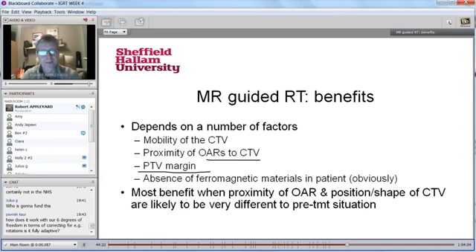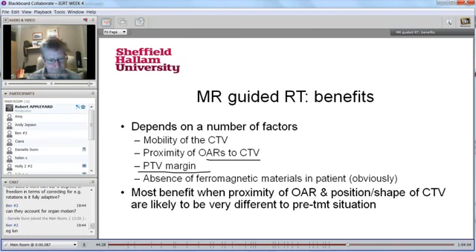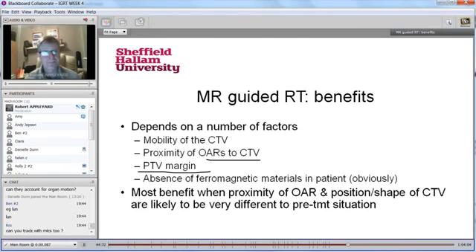That's the whole point, I think, of these MR-guided units, that they do allow for fully adaptive radiotherapy. Can they account for organ motion? Yes, definitely. If you have a look online, go to YouTube or go to some of the manufacturer sites, if you look at the ViewRay information, yes, it will account for organ motion.